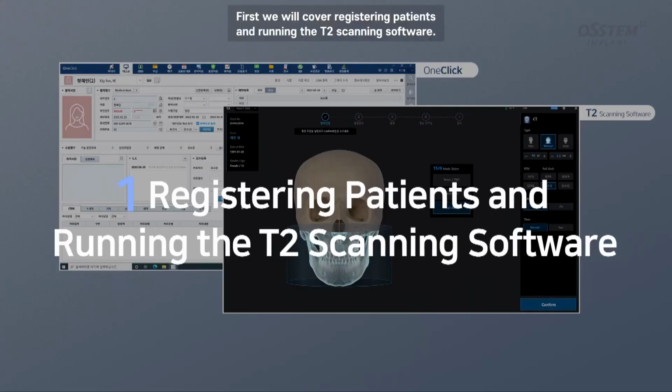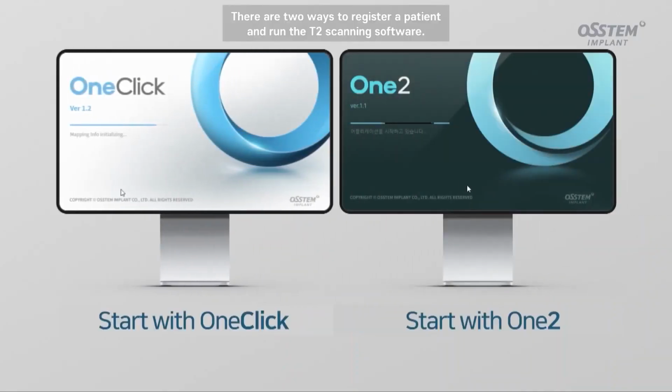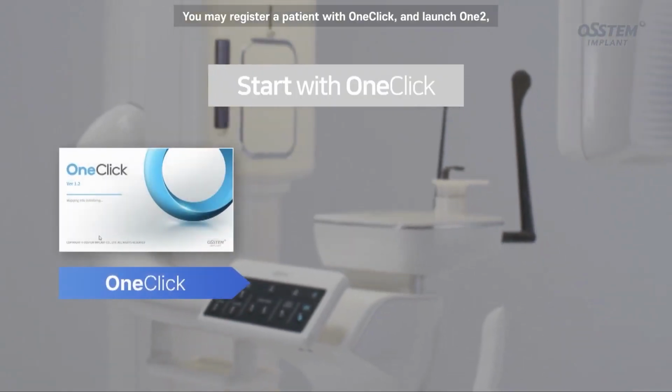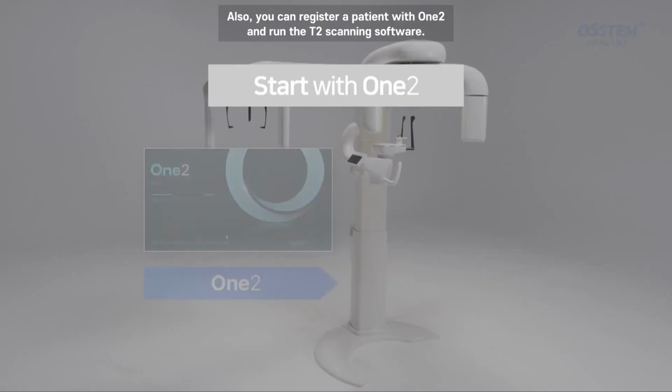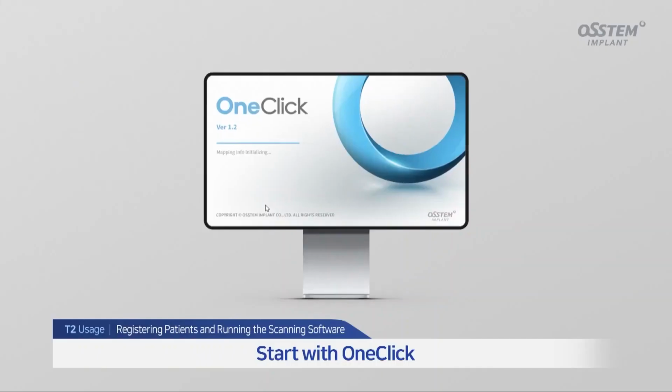First, we will cover registering patients and running the T2 scanning software. There are two ways to register a patient and run the T2 scanning software. You may register a patient with one click and launch OneTwo. Then run the T2 scanning software. Also, you can register a patient with OneTwo and run the T2 scanning software.